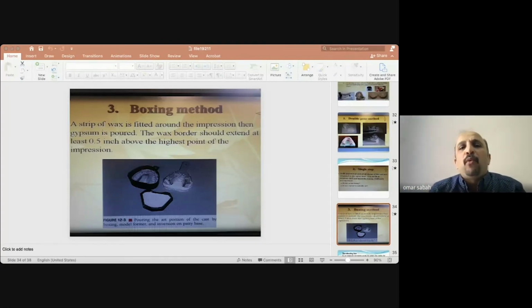بهالطريقه انا ضامن اول لاير ما بيها بابلز، انا شايفه بعيني اوكي، وما بيها اي ماتيريال وما بيها اي مشكله. فالماتيريال اللي بعد مجرد نعطيك الثيكنس. بعد ما خلصنا هذا الثيكنس لازم نعمل له بيس.